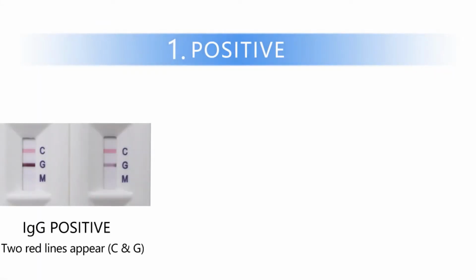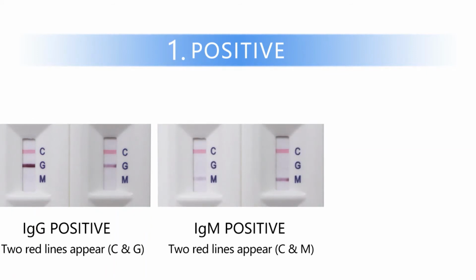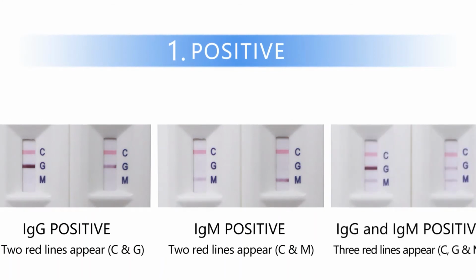IgG positive. 2 red lines appear on both C and G regions. IgM positive. 2 red lines appear on both C and M regions. IgG and IgM positive. All 3 red lines appear on C, G, and M regions.